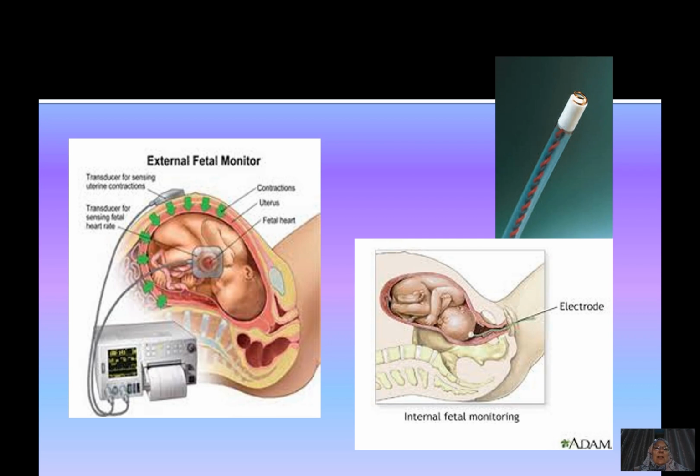First of all, to remind you how we take the CTG, I have already said that in the first CTG lecture. The external monitor, which is much more commonly used, has two probes. One is put on the fundus for the tocography, so the monitoring of the contractions, and the second one, the Doppler sound probe, is put lower down on the mother's abdomen. If the baby is cephalic, it usually has to be put below the umbilicus, to monitor the fetal heartbeat.